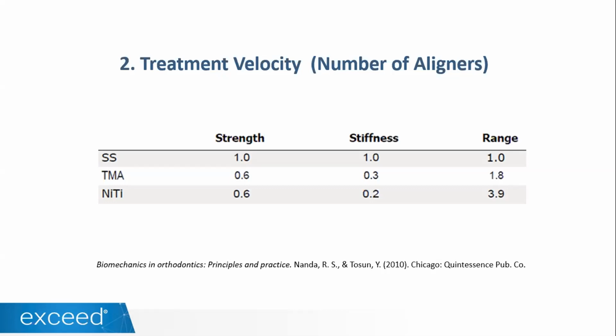So our recommendation is 2 week wear. Myself, I use those aligners every 1 week. This is something that you can also do when you already have more experience using this aligner, because you're going to see which movements happen faster and which ones don't. So one recommendation, if you want to incorporate this in the future, is that you can start by giving those patients 2 aligners, every 2 weeks.